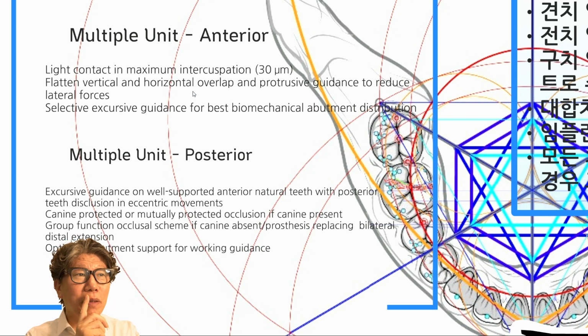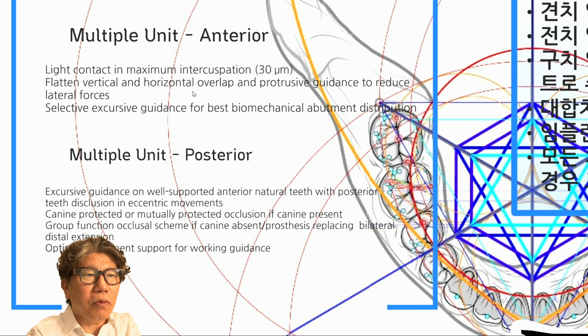Another funny thing is that controlling overbite and overjet was mentioned. Overbite should be reduced and overjet should be increased to reduce overlap. However, if only one implant is different in shape when there is a natural tooth, it is not aesthetic. So it seems to be a somewhat inconsistent situation. Therefore, when it's a full mouth or there are multiple implants, this is correct. I also think it is possible to intentionally adjust natural teeth to control the overall overbite and overjet. Otherwise, when only a single crown is used, it becomes an illogical situation. In my experience, we have reviewed these points together.